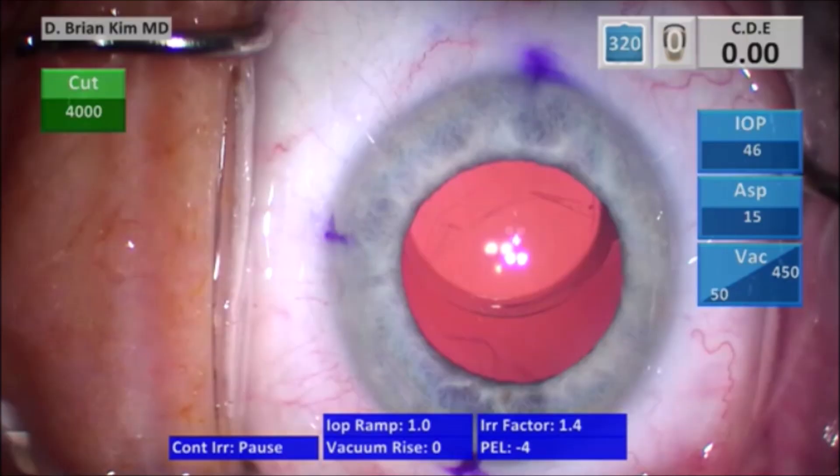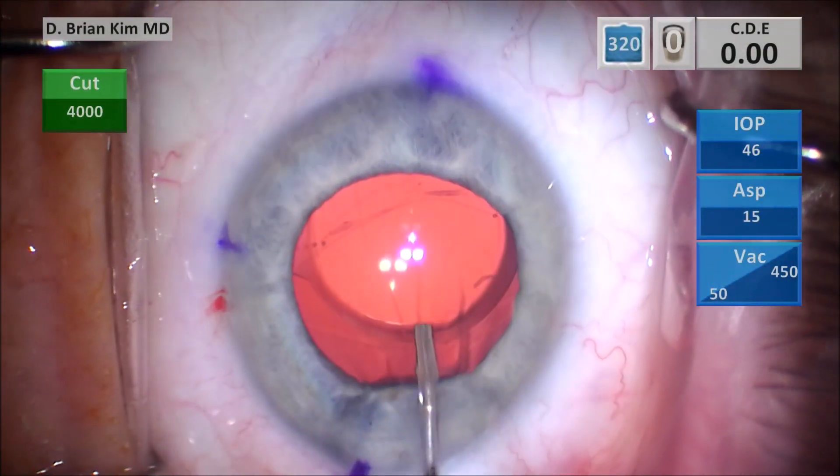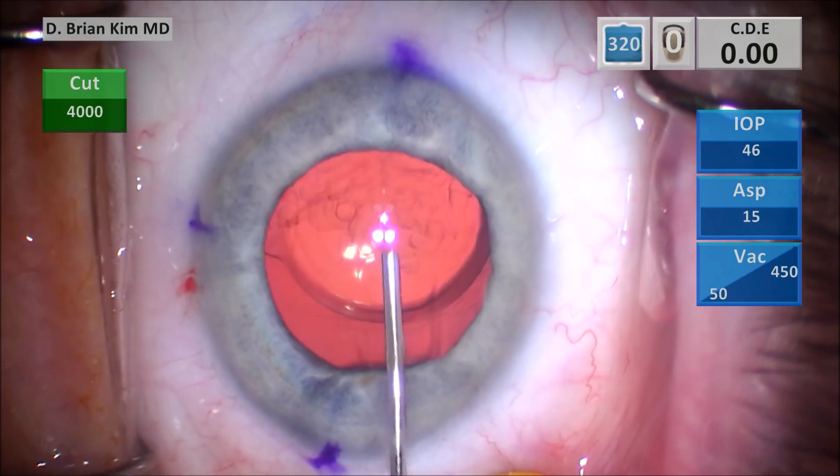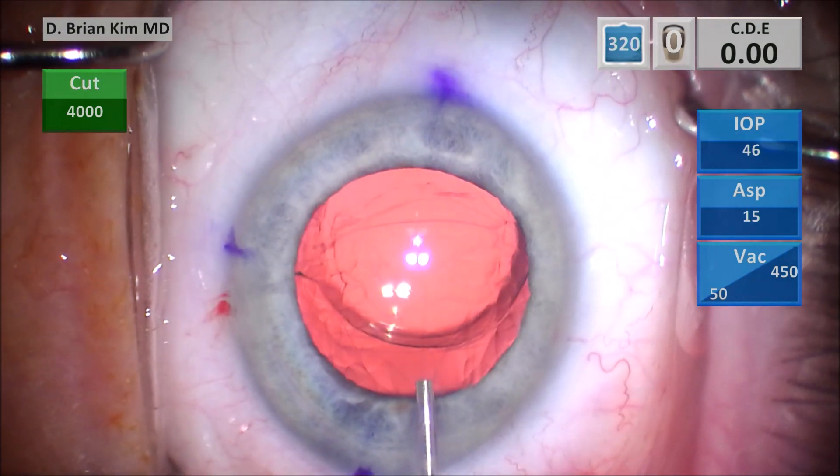The rhexis is a little bit smaller than ideal, but I'm hoping that because the rhexis is intact, the anterior capsule is intact, and the zonules are intact, I can reverse optic capture this lens — assuming there are strong enough zonules and a strong enough anterior capsule. At this point, I'm injecting some dispersive viscoelastic in the anterior chamber to fill the bag and coat the corneal endothelium.